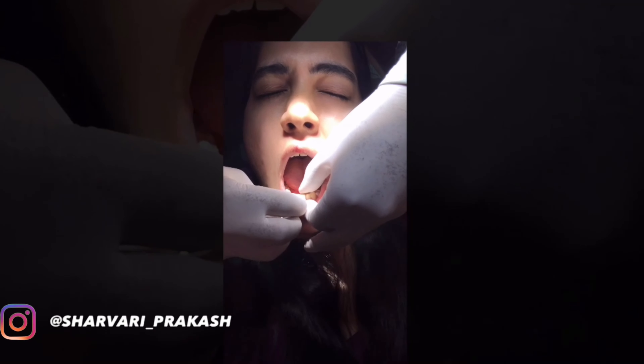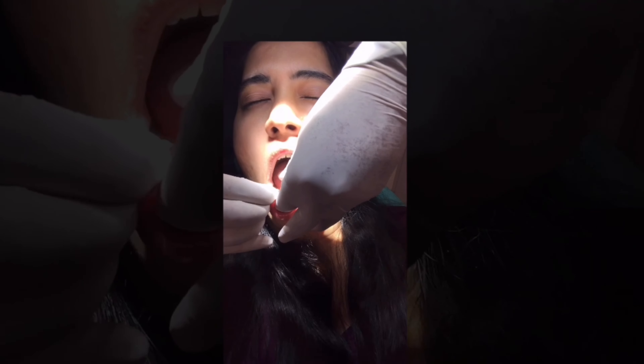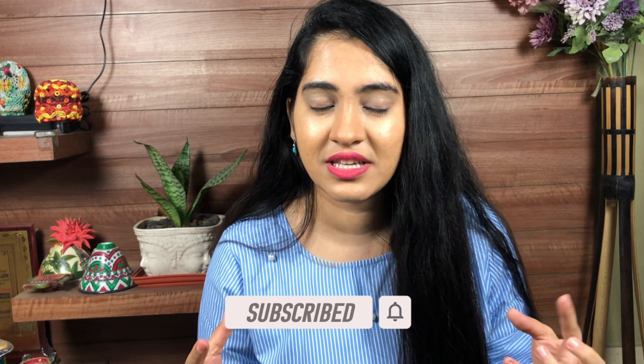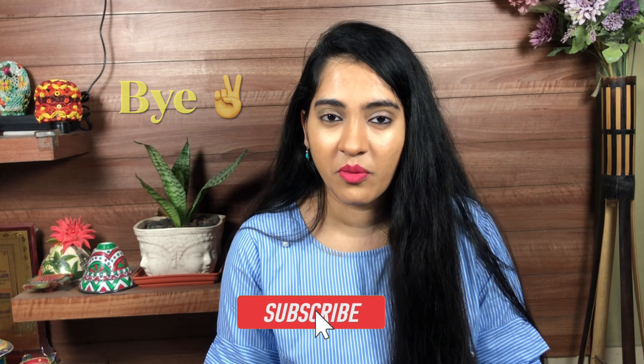Now put your tongue back. I hope you guys liked the video. I'll tell you about the complications, but the most convenient thing is that I can remove these aligners and eat whatever I want.